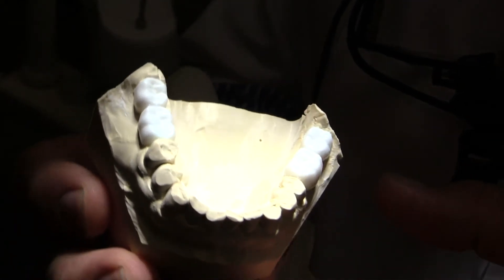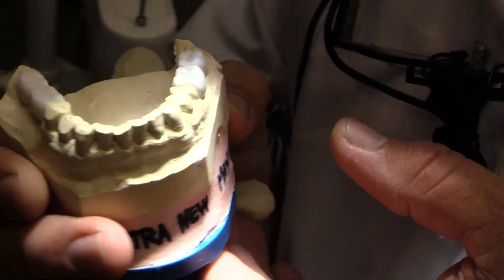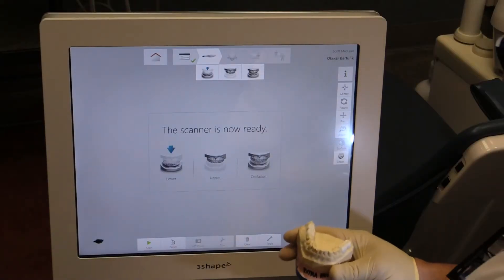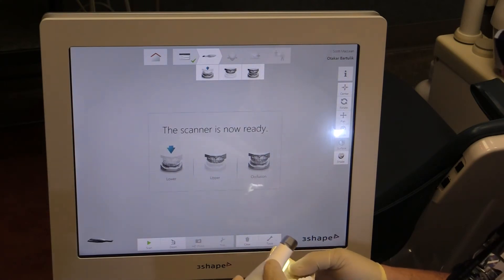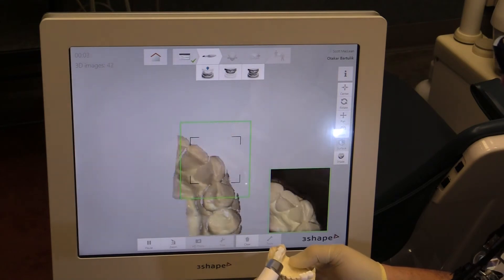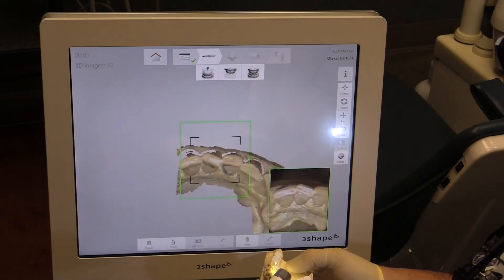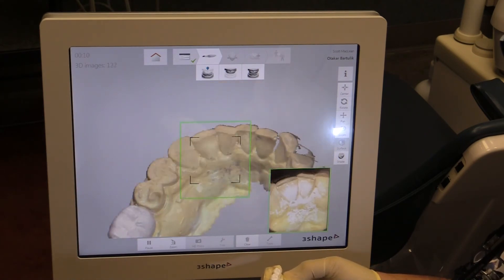If you look at this video, what we're going to do is take two wax-ups my technician did on a standard gypsum model and see how fast we can scan this. This model is part of a full mouth reconstruction case where we're doing articulations and addressing a lot of issues — otherwise we would just take it now and scan in the mouth.